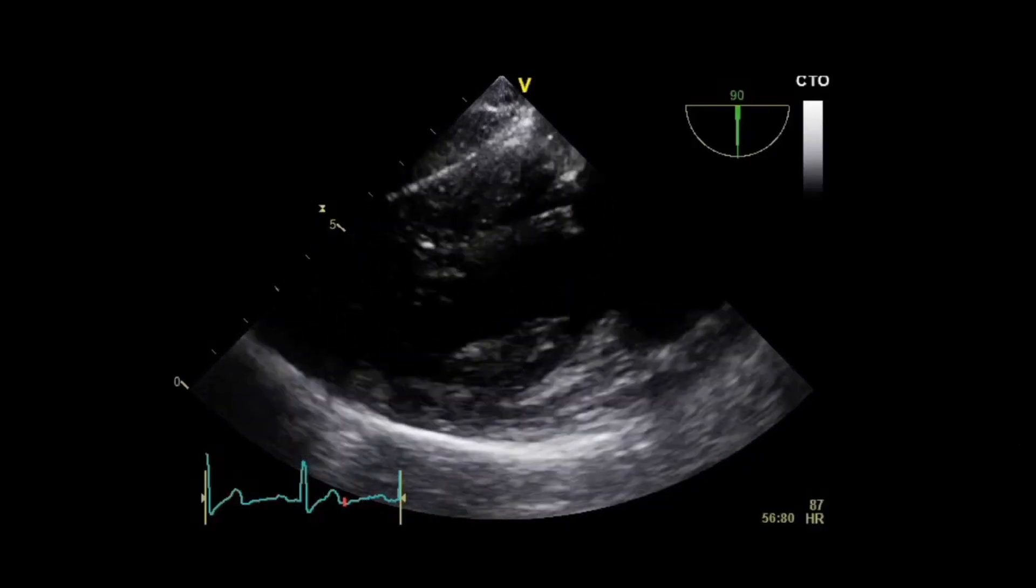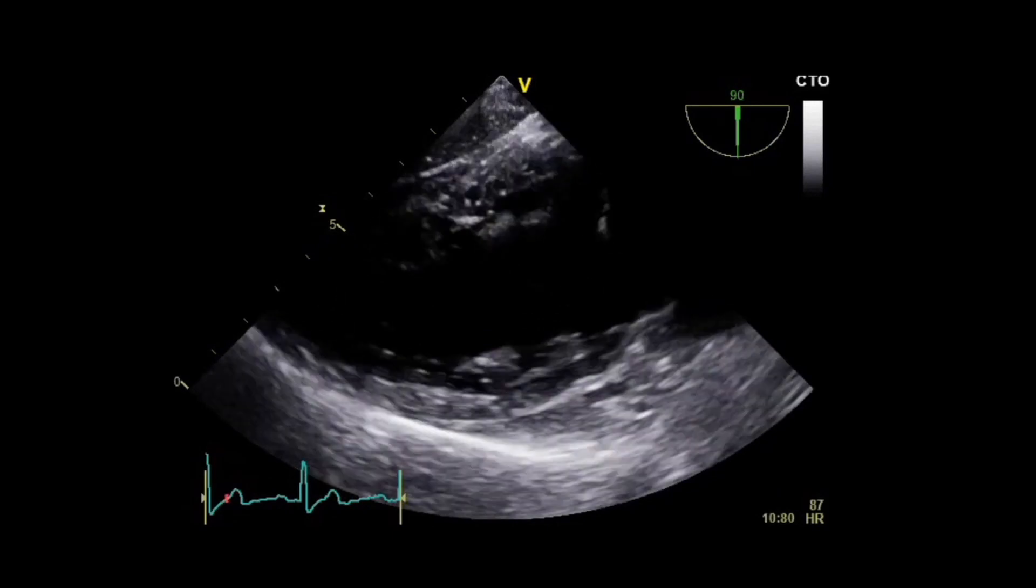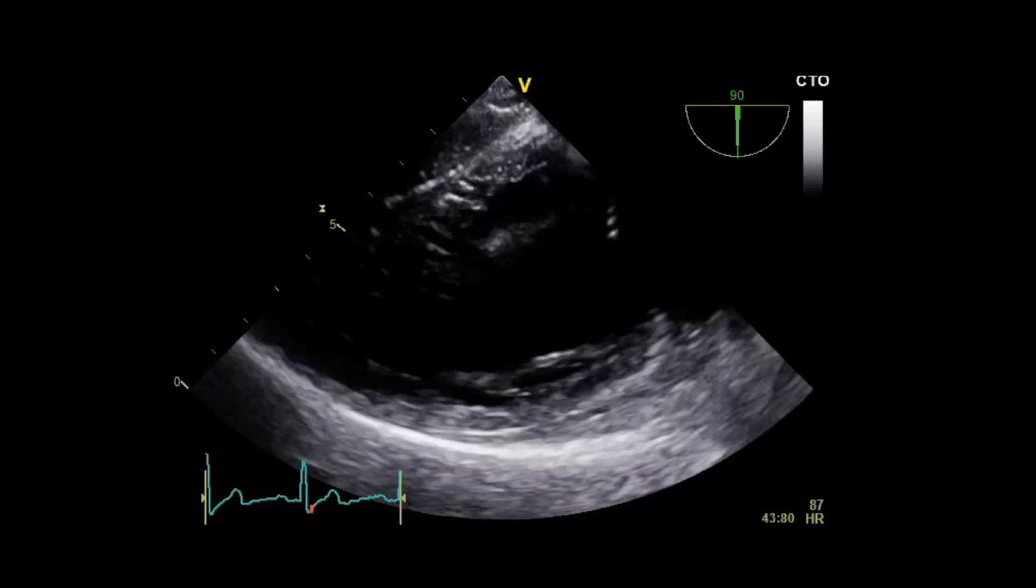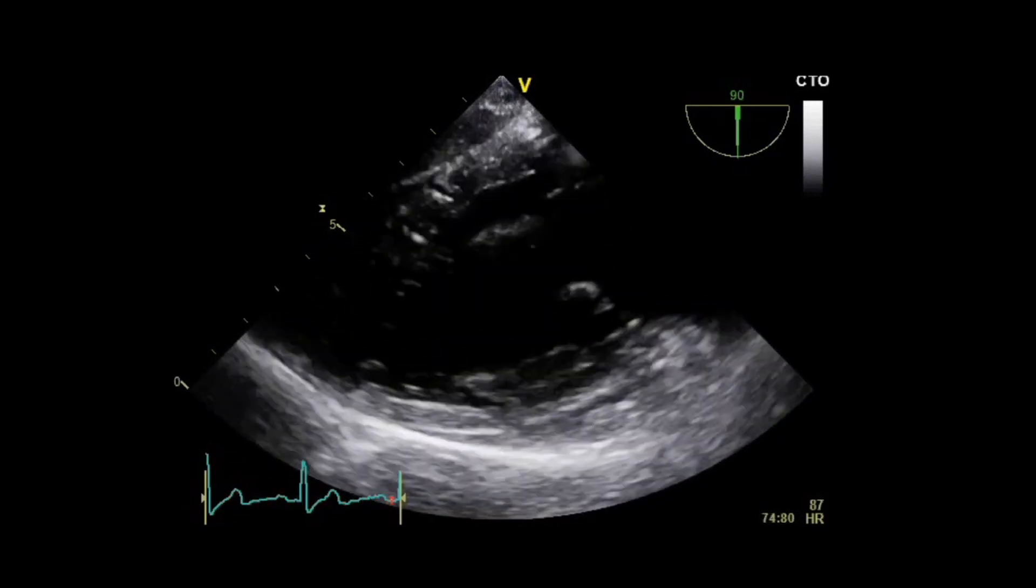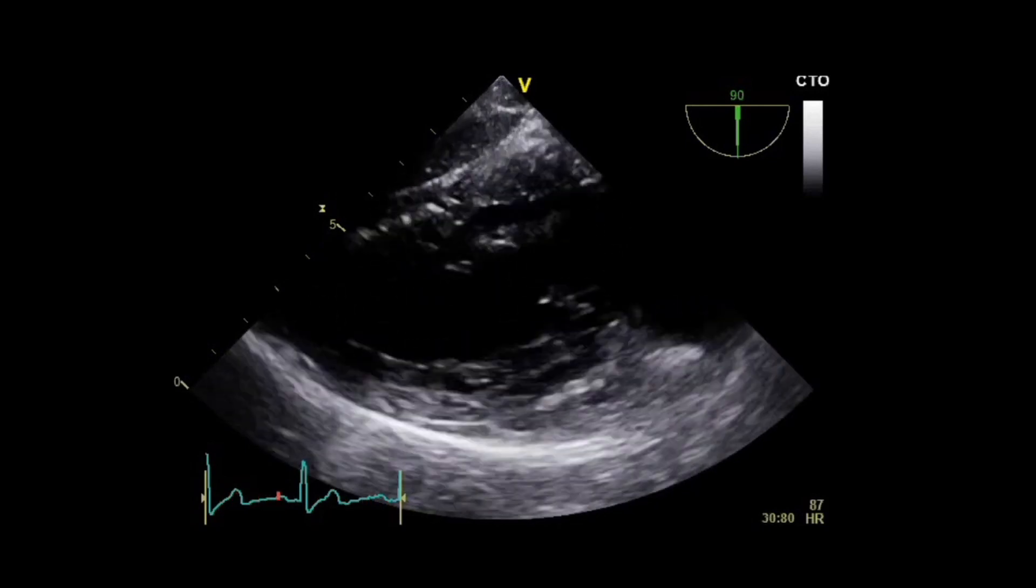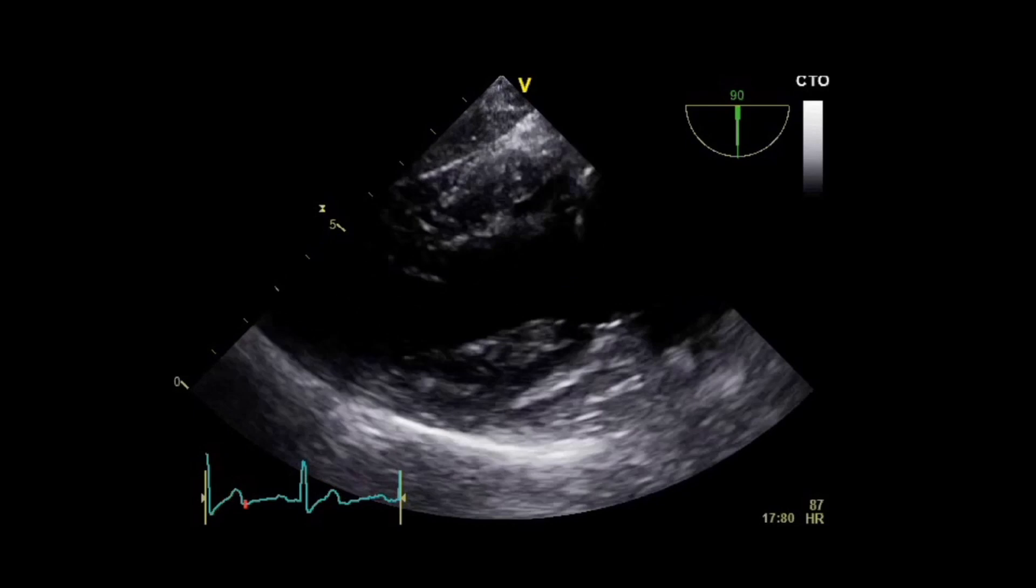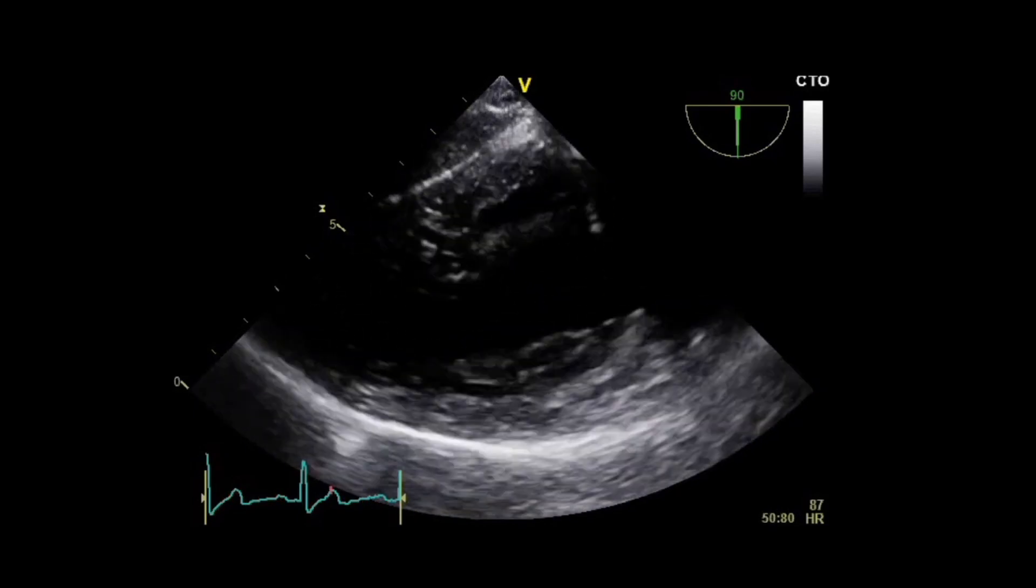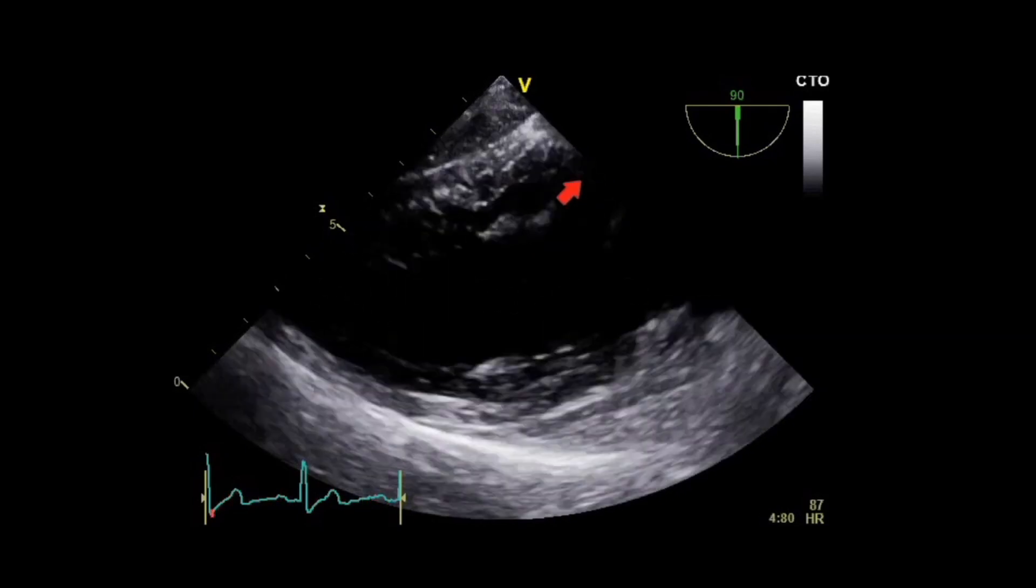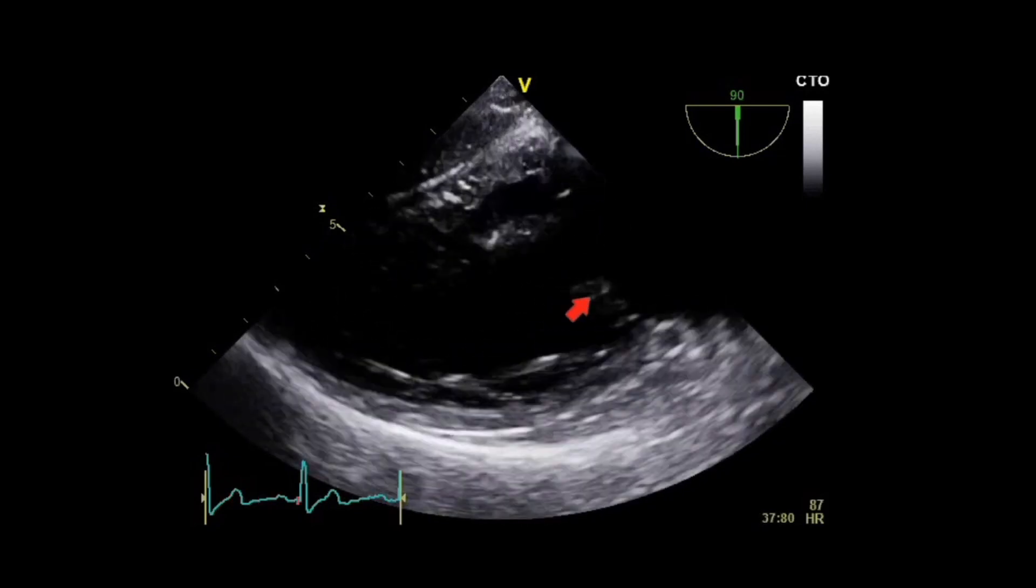And we get to see the subvalvular apparatus particularly well on transgastric views. This is a two-chamber transgastric view which shows the left ventricle here, the papillary muscles, the chordae tendineae and their insertions into the mitral valve leaflets.